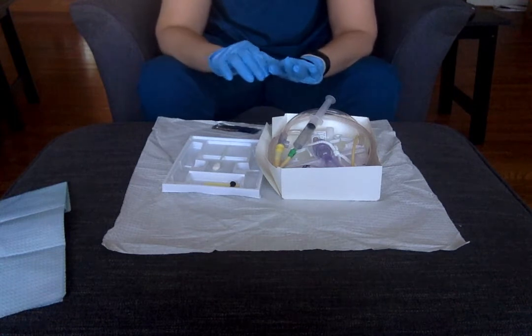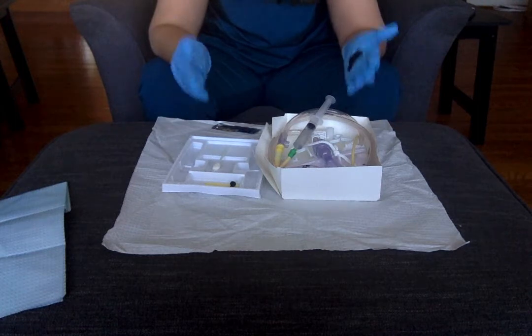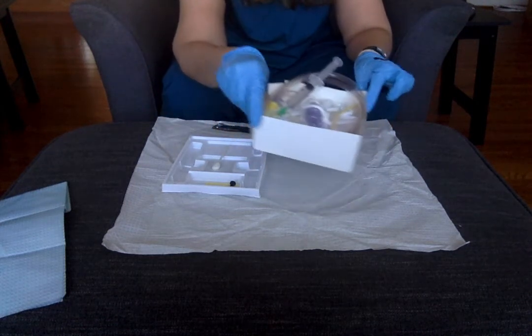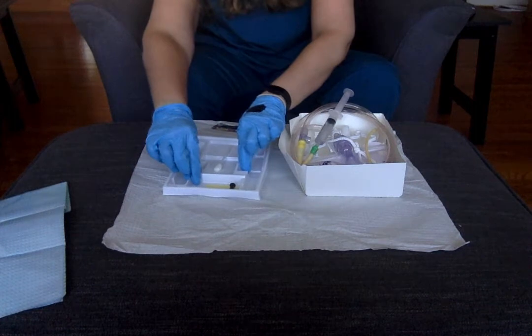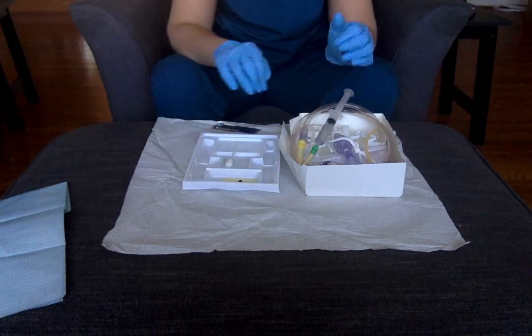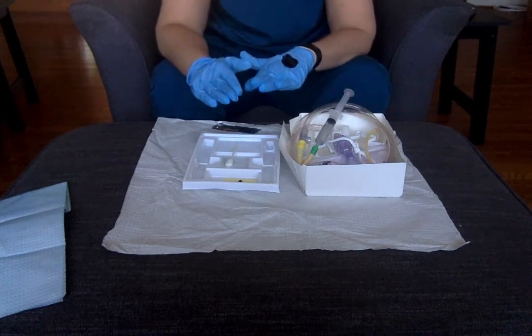So I've got everything set up on my kit. Now you can either start with this between your patient's legs, or you can move it at this point. To move it, I would be grabbing the top of the box here and I could set this between my patient's legs. I can also grab inside this kit and set it between my patient's legs as well — I know that's on your checklist. So at this point, I am ready to go ahead and insert.